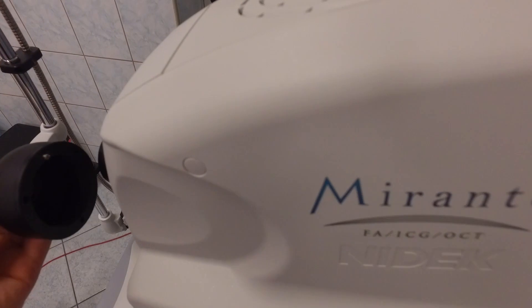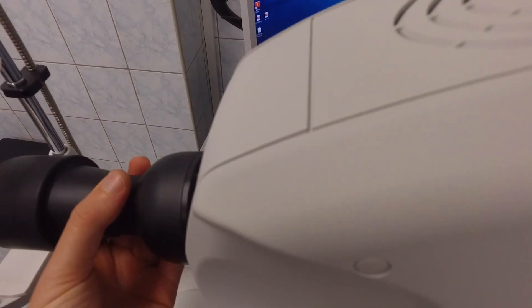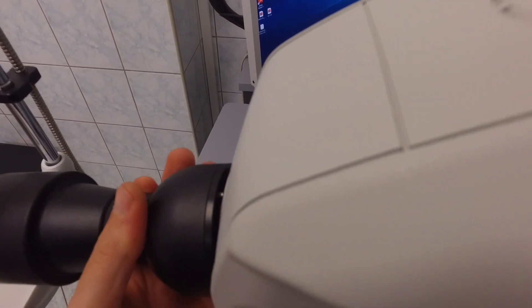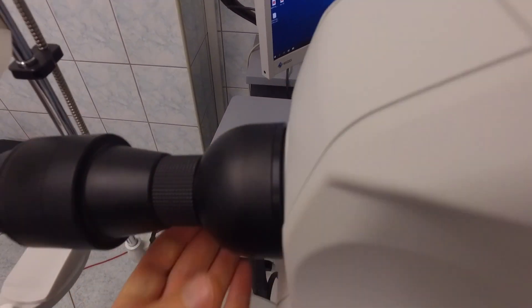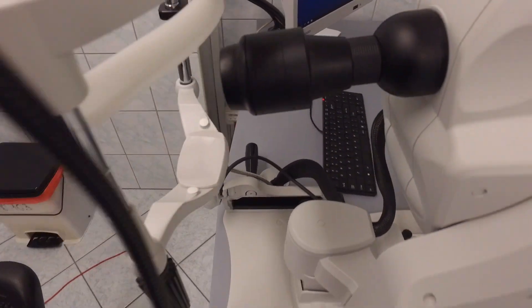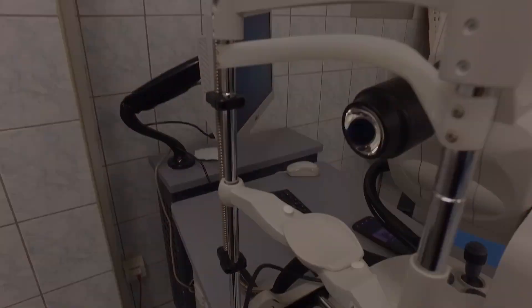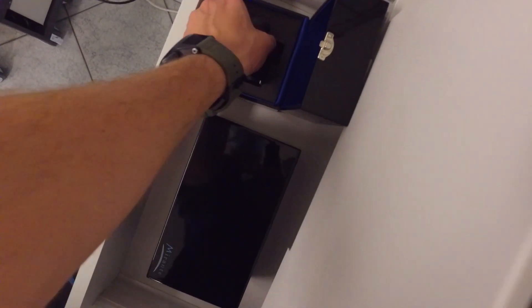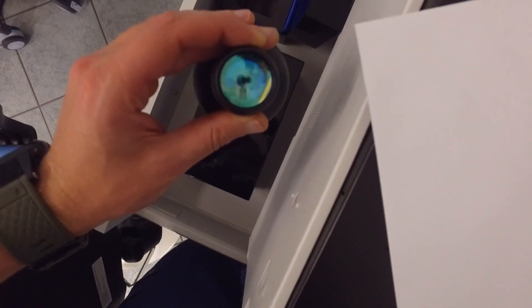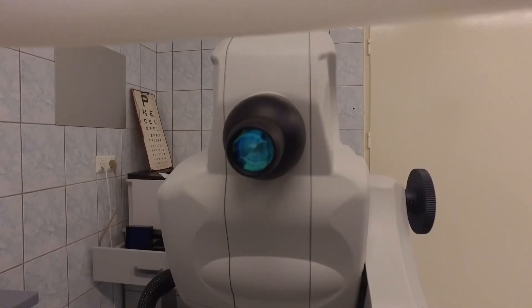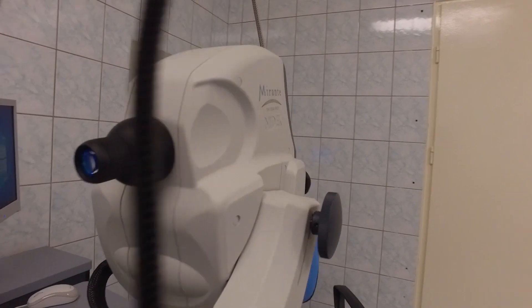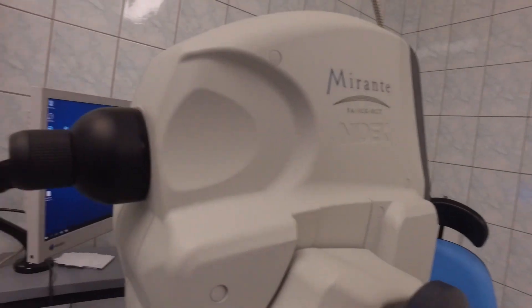There are also two additional add-on lenses. This is the ultra-wide field lens. They all attach to the device using a magnet and there is also a smaller lens used for the anterior segment imaging and it looks like this.